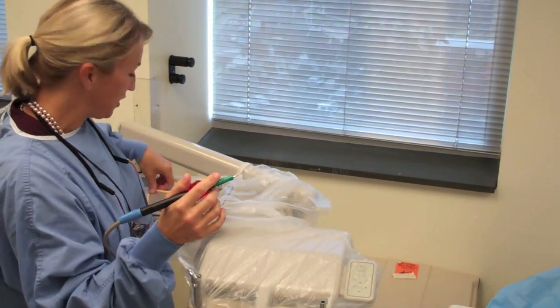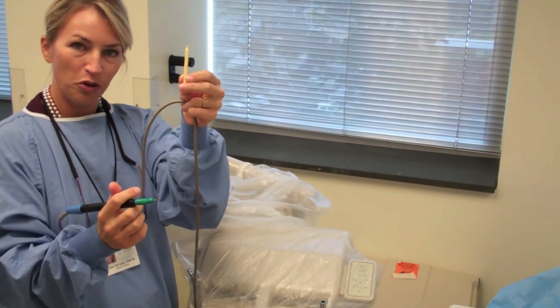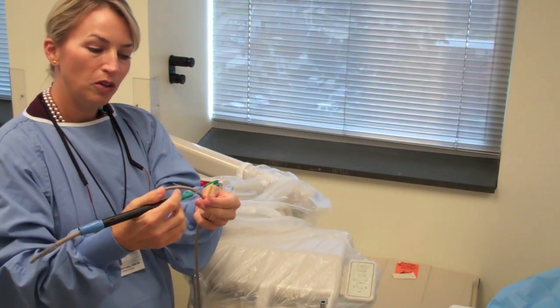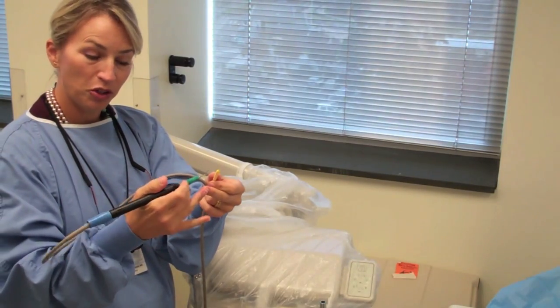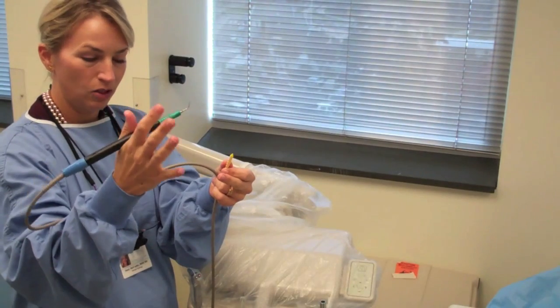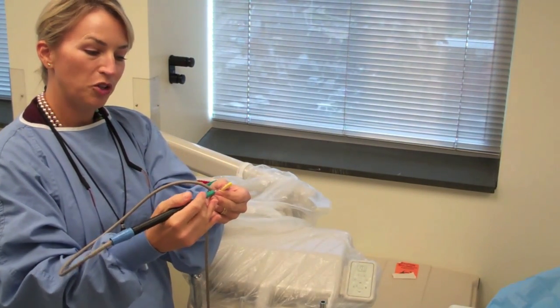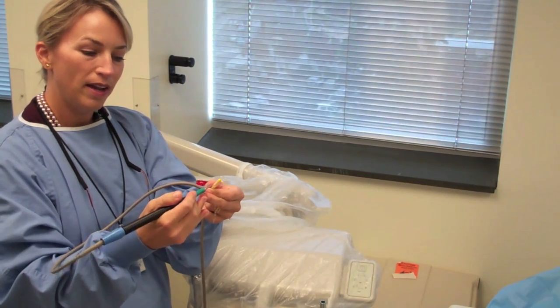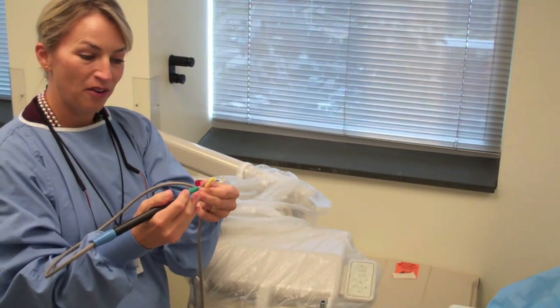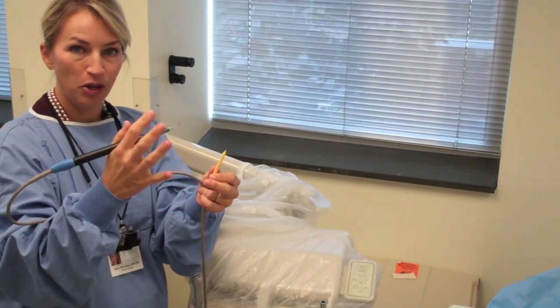Now, one of the neat exercises she had us do is to actually take a birthday candle. This is your traditional birthday candle that you put on your kids' birthday cakes. We did an exercise where we looked at the light amount of pressure that you actually use during instrumentation. With the insert resting really loosely between your thumb and your index finger, she had us instrument off the white of the candle without getting down to the colored section of the candle. It really was a great exercise to teach us how incredibly light the pressure needs to be.